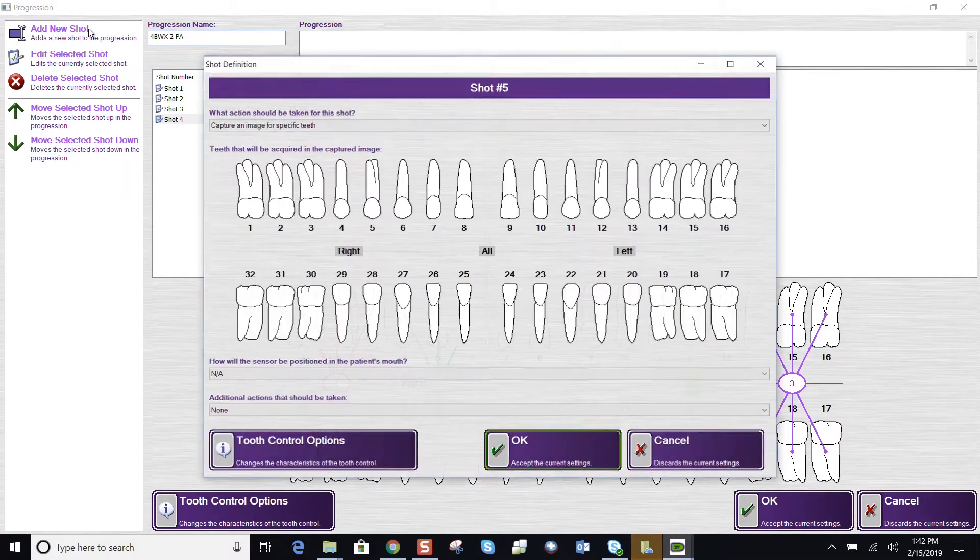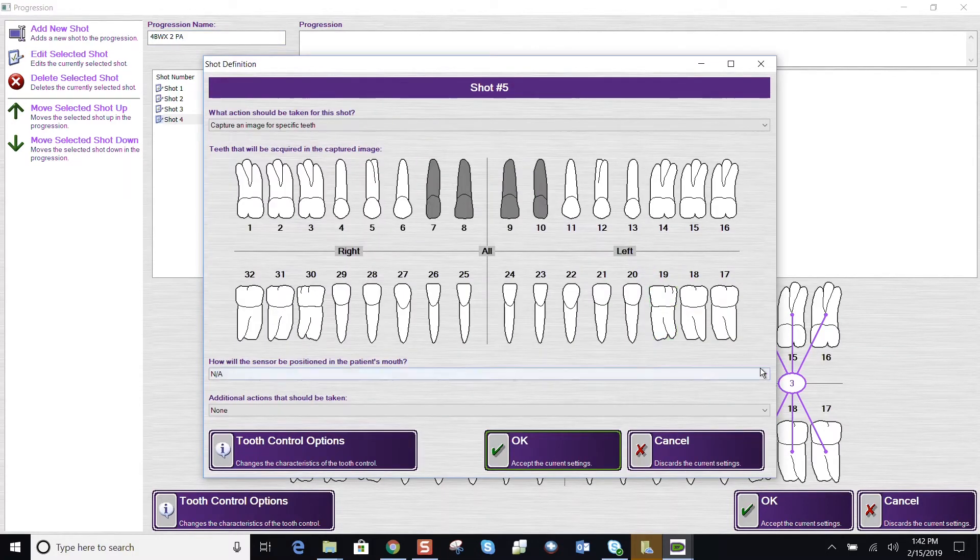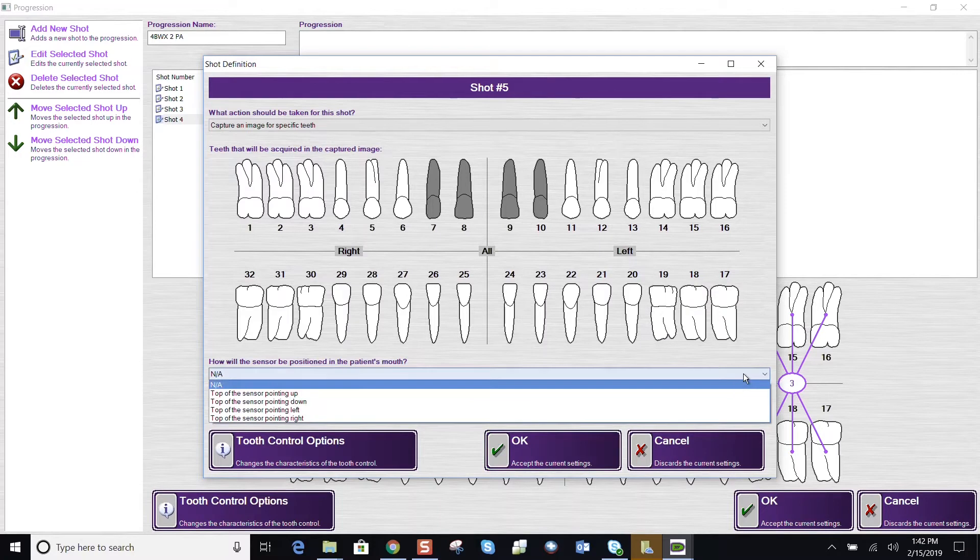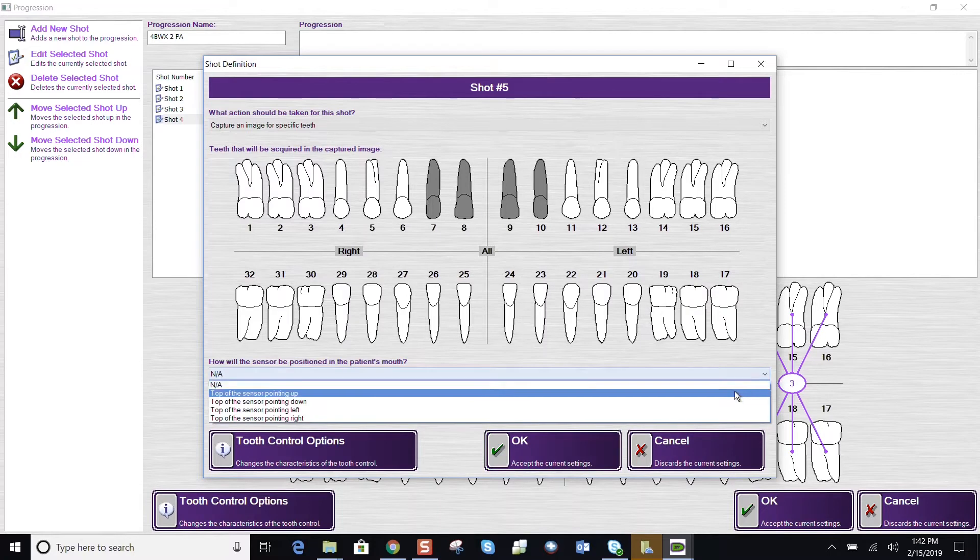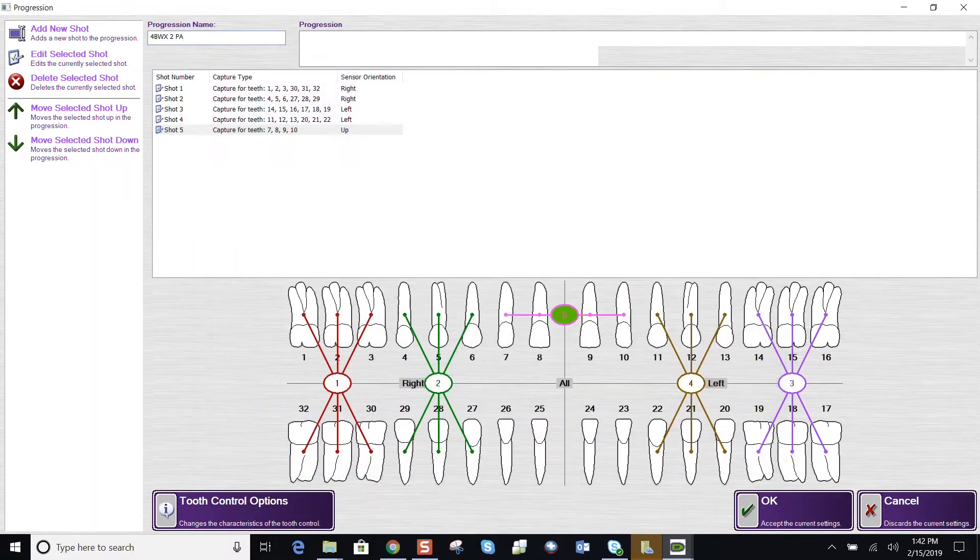My fourth shot, my upper anterior teeth. Highlight those teeth. And now the top of the sensor is pointing up into the palate. We would say OK.